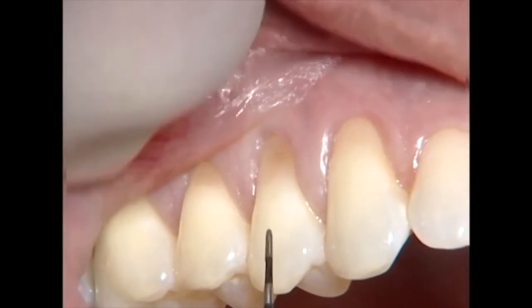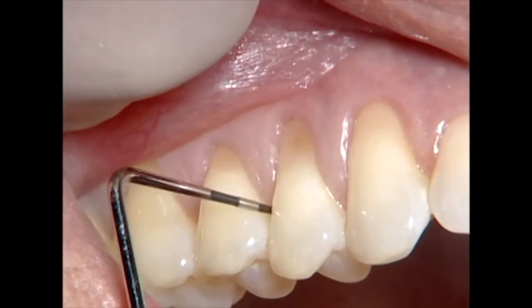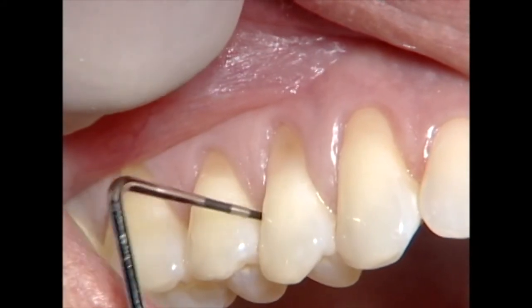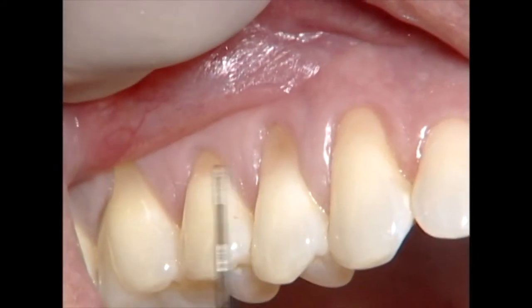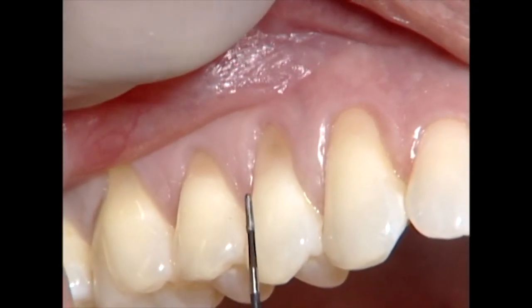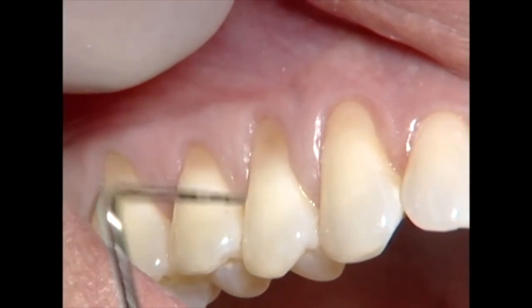So this would be class one recession, this would be class two. There's a little bit of loss of papillary fill because I can pass the probe through the contact rather easily. So there's some very early loss of fill and loss of fullness, which can impact our root coverage a little bit. So we'll lift these papillary to try to overcome that.